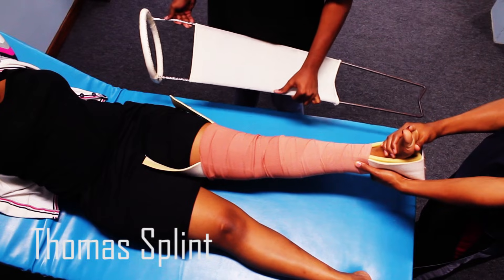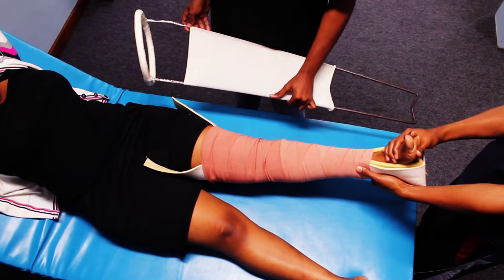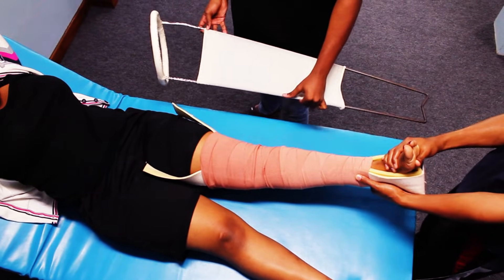This is the orientation in which the splint should be inserted, with the ischial tuberosity sitting on the rim. You should not insert it the other way because it becomes ineffective and predisposes to pressure sores in the groin.